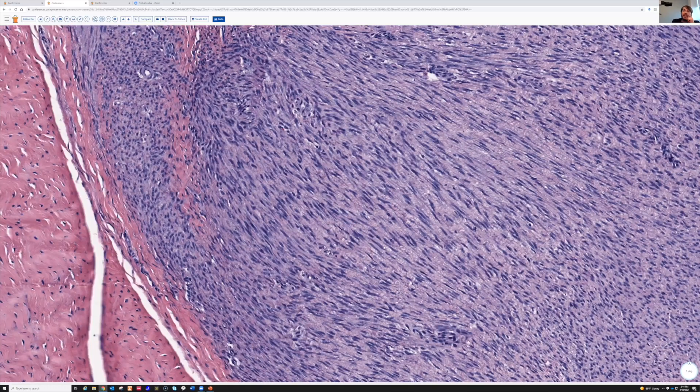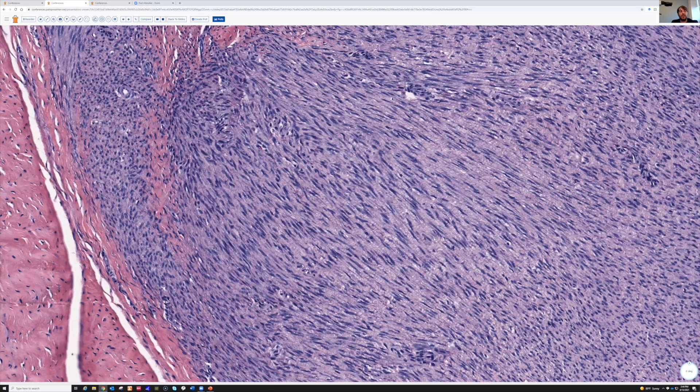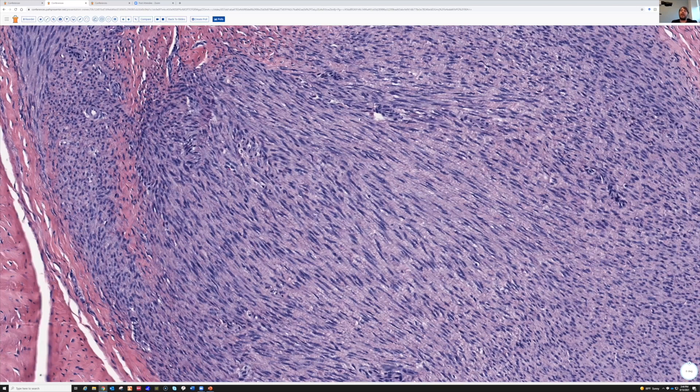The spindle cells — a few of them touch each other, but most of them are not touching each other. They're divided by pink bundles of fine, delicate collagen in between. Those features together are characteristic of fibromatosis. In the deep soft tissue, when you see this pattern, you think of desmoid fibromatosis.